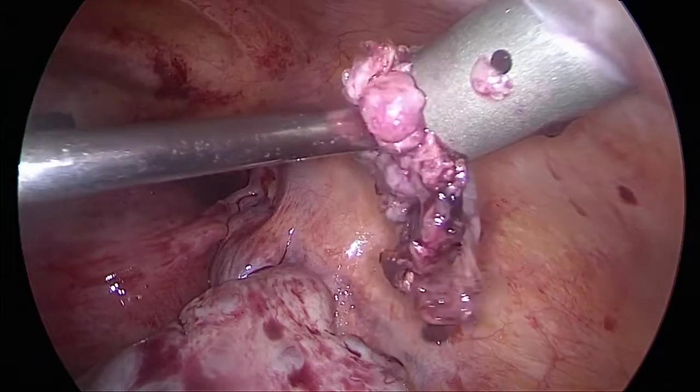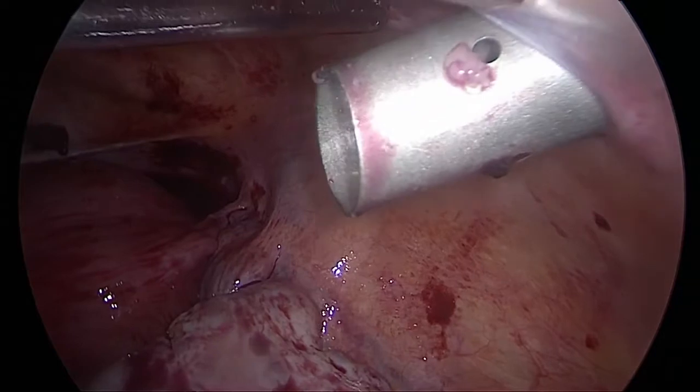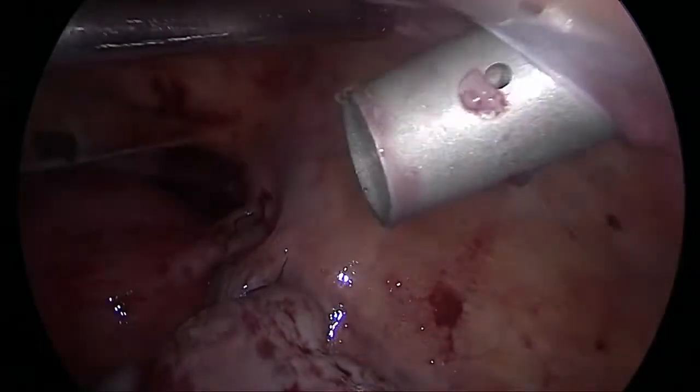We converted one of the 5 mm ports to a 10 mm retrieval port, and using a toothed grasper we were able to retrieve the ectopic mass.